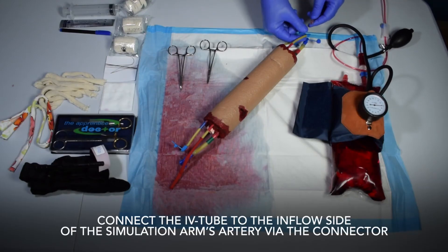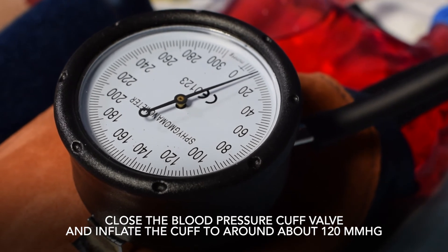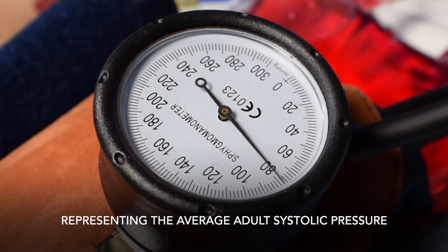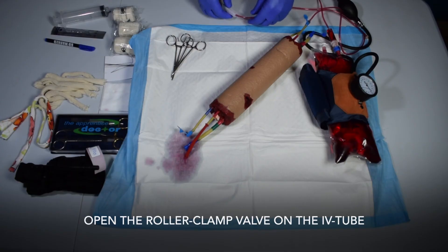Connect the IV tube to the inflow side of the simulation arm's artery via the connector. Close the BP cuff valve and inflate the cuff to around 120 mmHg, representing the average adult systolic pressure. Open the roller clamp valve on the IV tube.